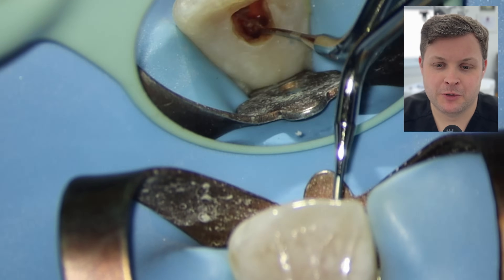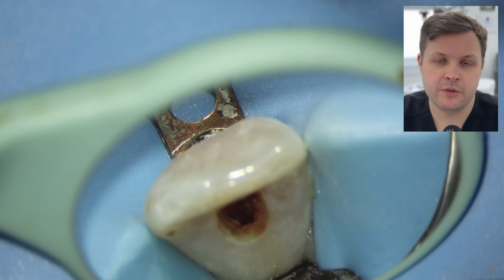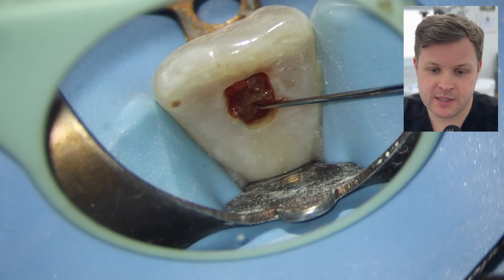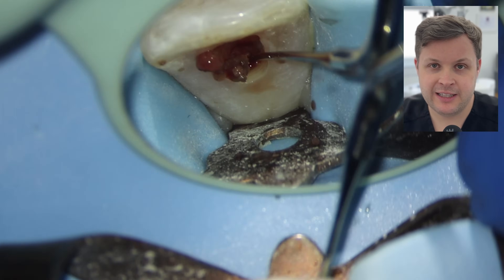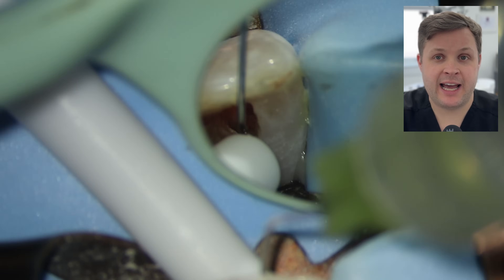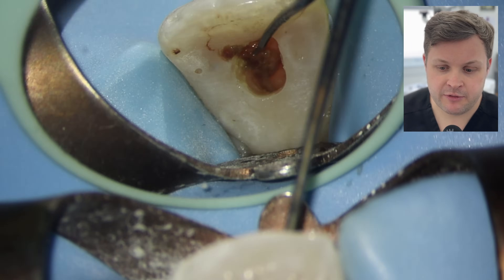You're trying to remove the pulp and you just think it's so loose — maybe you could just dislodge it. Then 20 minutes pass and you think, what are you doing? I've got to the point where I'm spending so much time on this tooth. I just need to get on with the case. So what I've decided to do is just use a bit of hypochlorite to dissolve this pulp definitively.